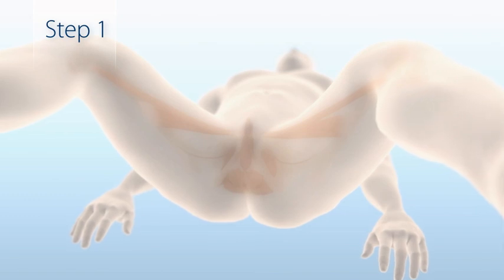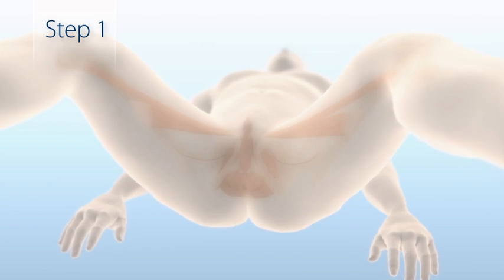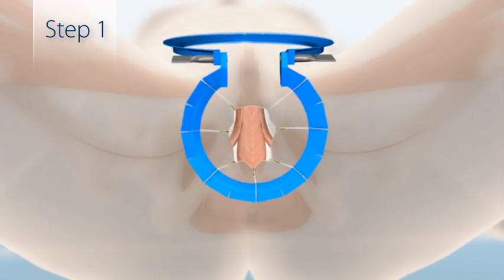To prepare for the AdvanceXP male sling procedure, the patient is placed in dorsal lithotomy position, with legs bent at 90 degrees and slightly spread, no further than shoulder width apart. The procedure begins with a low midline perineal incision through the skin and subcutaneous tissues.